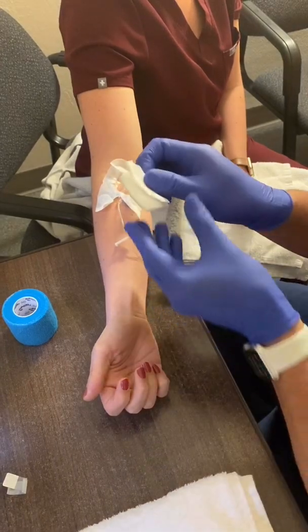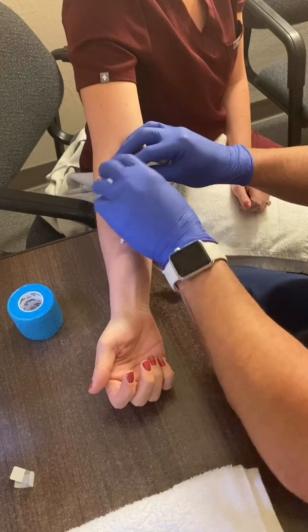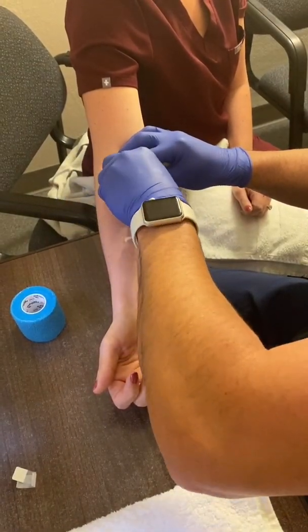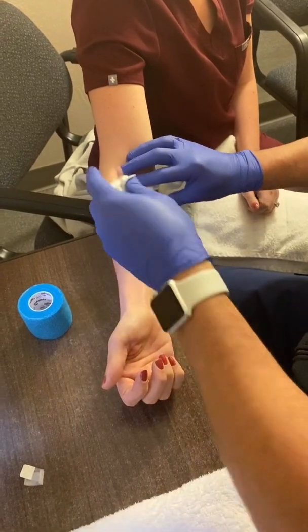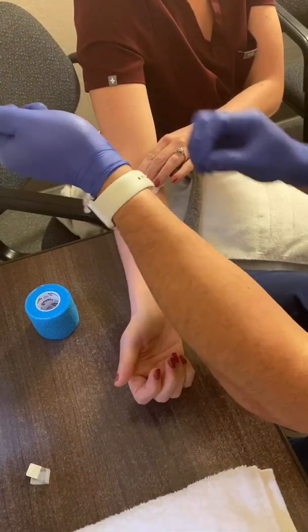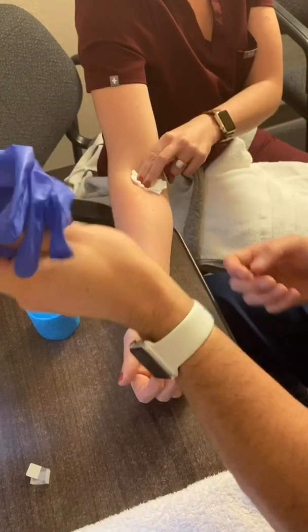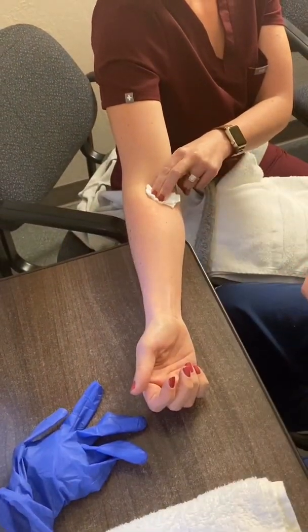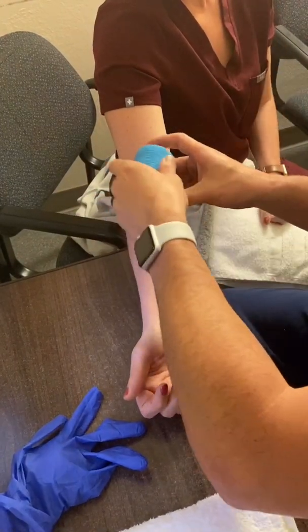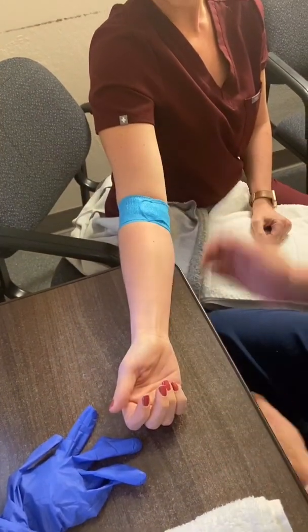This is where I have my gauze. And as I'm pulling back, get the tape off. You can see here, I just do it all in one motion and put slight pressure here. Once I do that, I will ask the patient to hold pressure. I keep it in the glove, wrap the whole entire IV catheter in my glove, take Coban, wrap it around, not too tight of course, and voila, there you go.